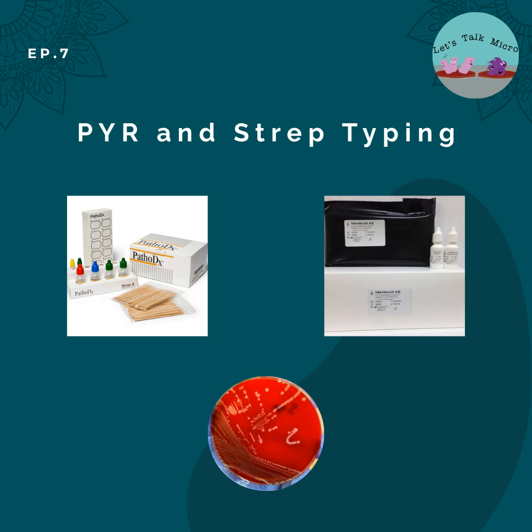While you're getting more proficient and while you practice and continue doing it and doing it, it's good to go ahead and apply it on more than one area, and then that way you're sure about your result. So once again, question time for the students. So what is this test used for? First of all, let's start there.